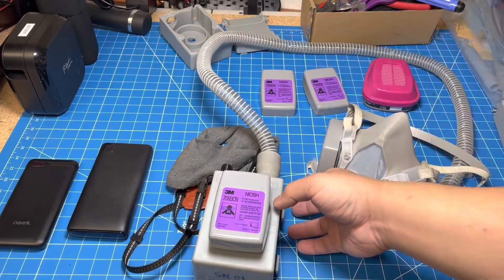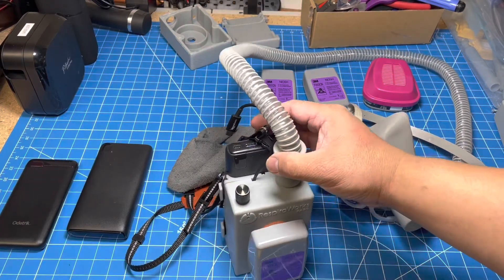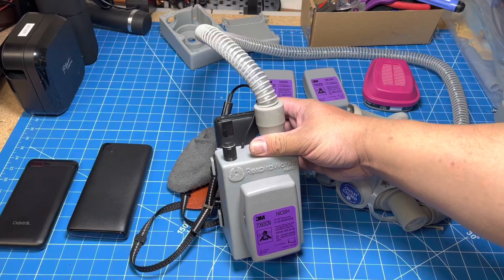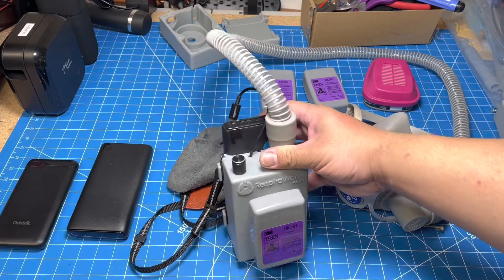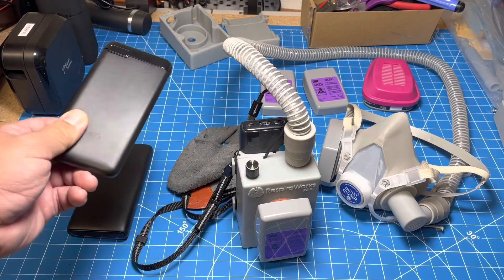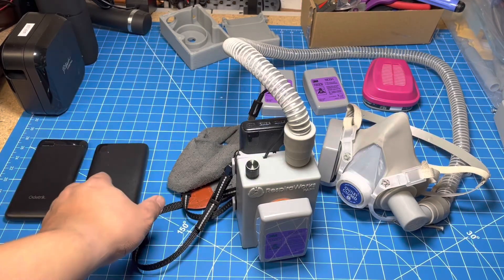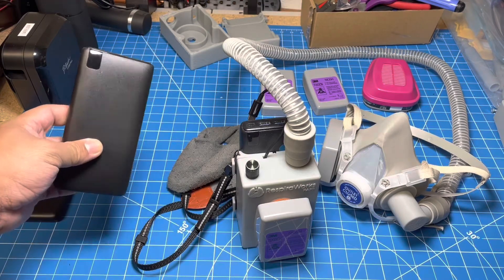We've also designed our PAPR to be powered by USB-C, which gives you a lot of different choices in how you want to power the device. You can power it from many different common USB battery banks as long as they support the Power Delivery USB-C 18-watt profile. For example, a small battery pack like this will give you 8 to 10 hours of run time. And if you need longer run time, or if you're using something like a full-face helmet that requires greater flow, you can use a larger battery pack like this, which will give you a run time of between 24 and 30 hours.